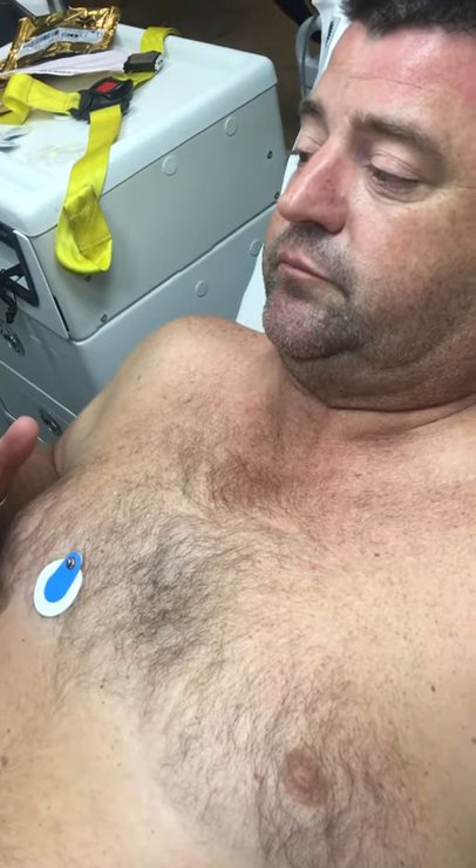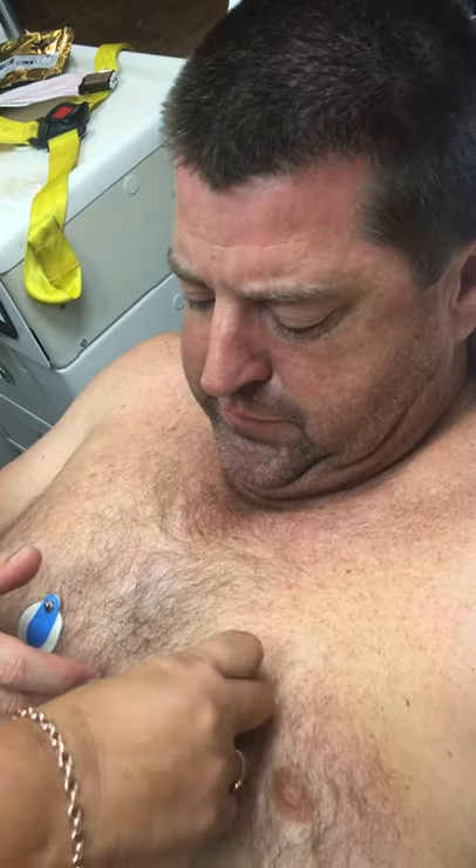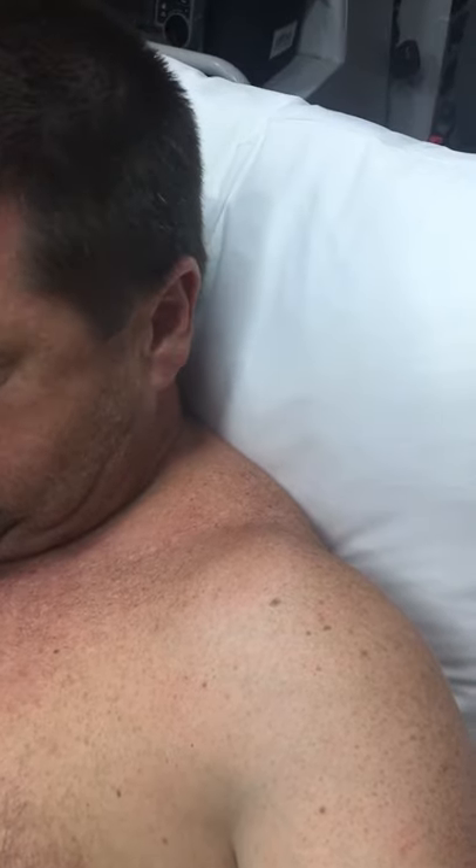V2 goes fourth intercostal space, left sternal border — just over the other side. I'm in the centre there, so you need to go about there. Now you're going to place V4. V4 goes on the fifth intercostal space — that's the next one down — mid-clavicular line. You see my clavicle up here? Mid-clavicular line is there, so it's going to go basically down to there. Fifth intercostal space.